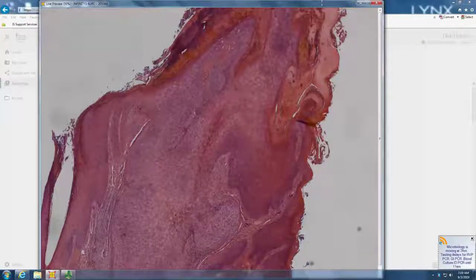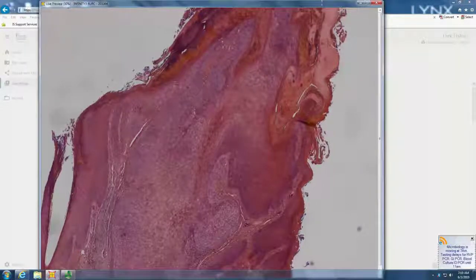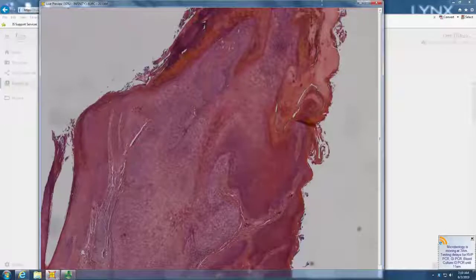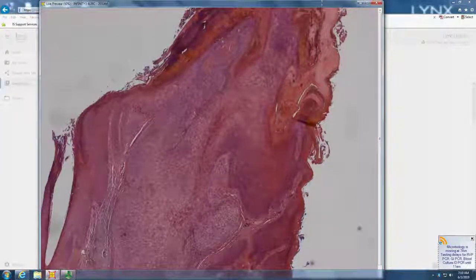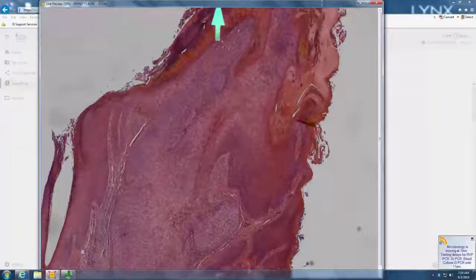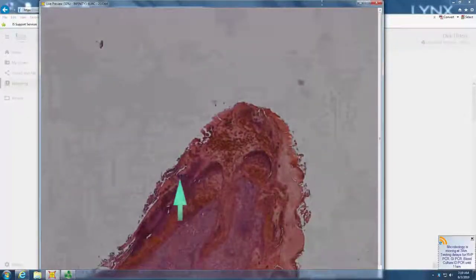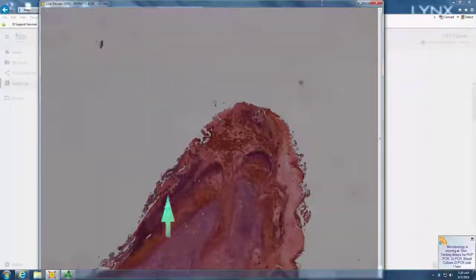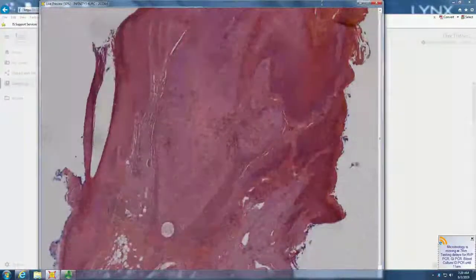Looks like it's here on crust. So there's a crust, and in that crust you have lots of staph bacteria, staph colonies, which we'll point out in a second. So a little bit of PEH. So here are all the staph colonies. Let's get them where everyone can see. There, staph colonies, and then crust, PEH, and then the lesion itself.